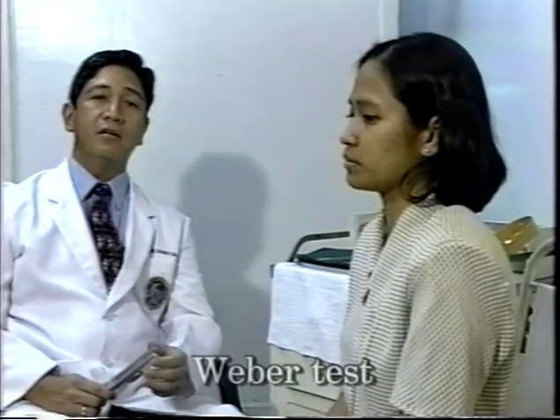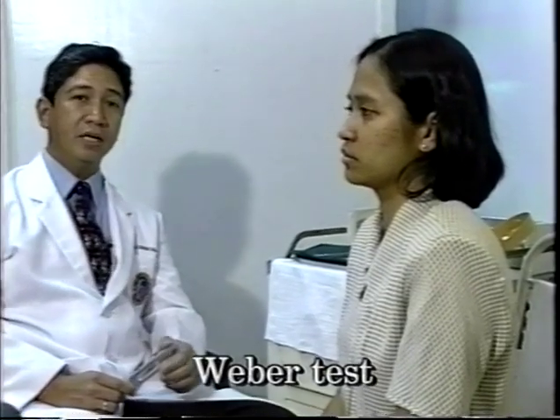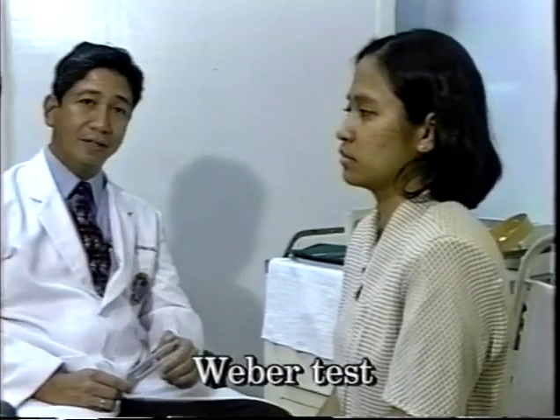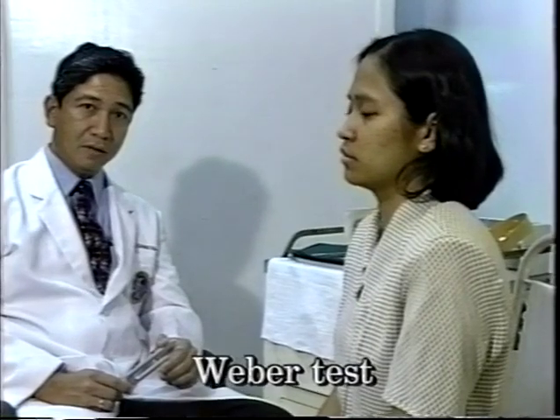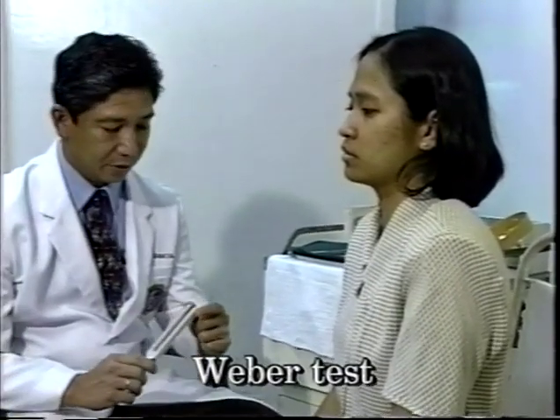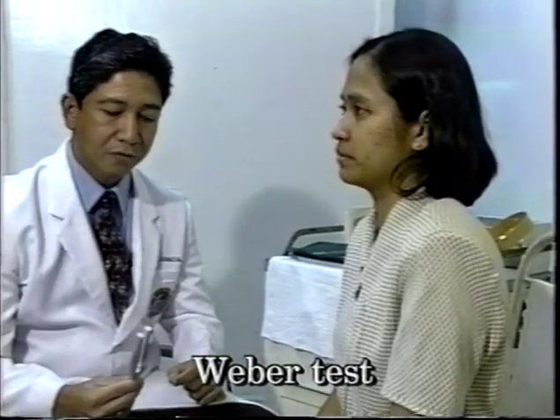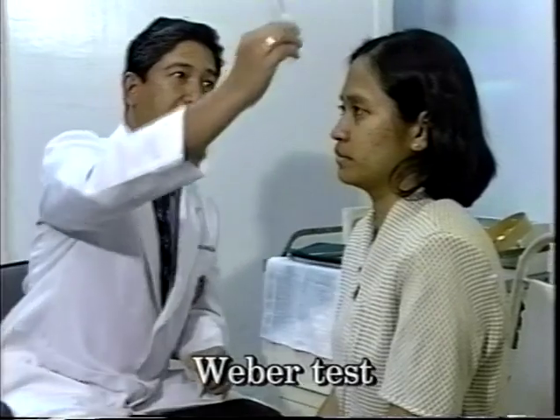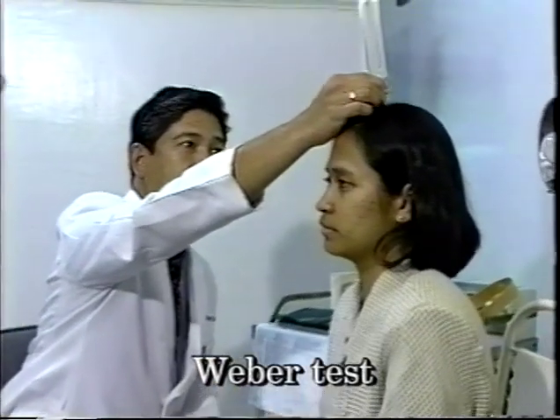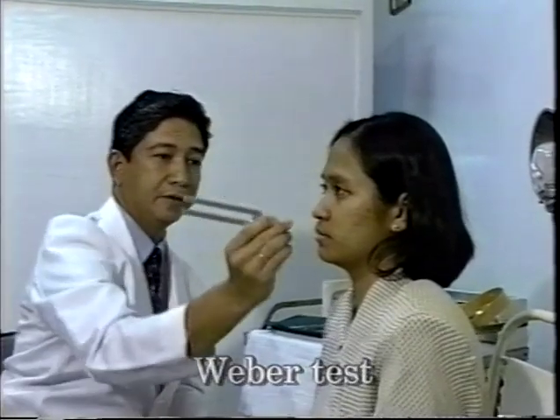The first test is a Weber test. The Weber test is actually a test for lateralization. You briskly strike the tuning fork between the index and the thumb and allow the tuning fork to vibrate, and then place the tuning fork at the forehead or any part in the midline.